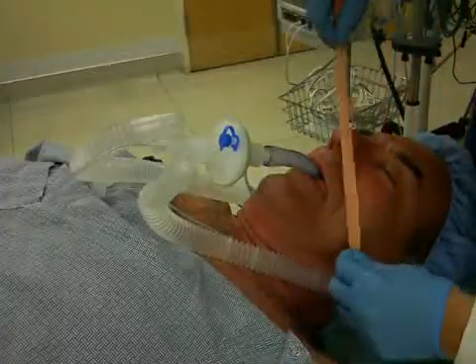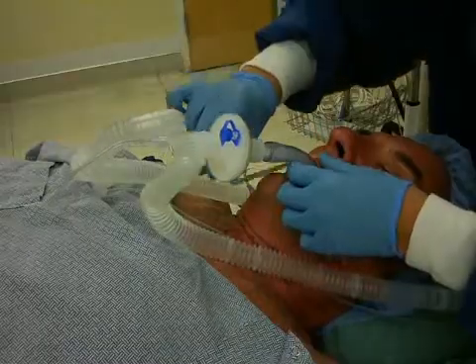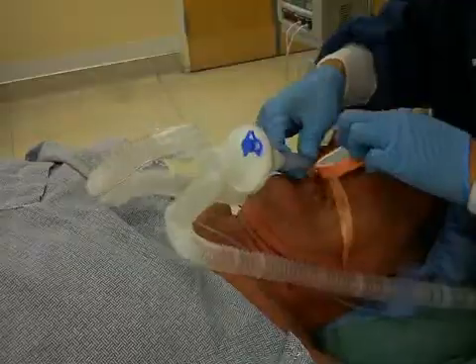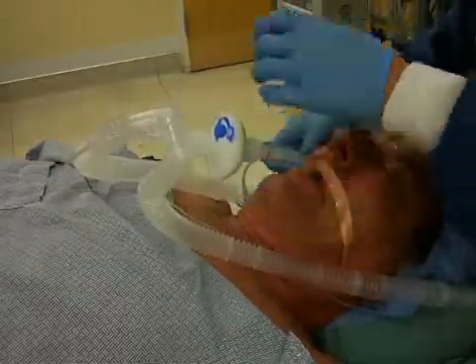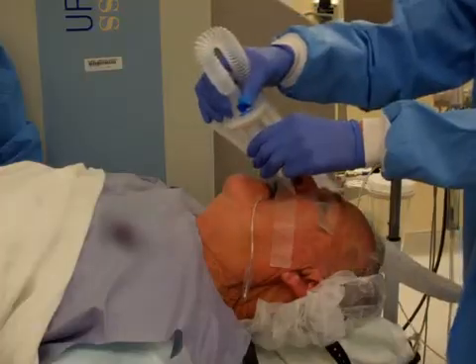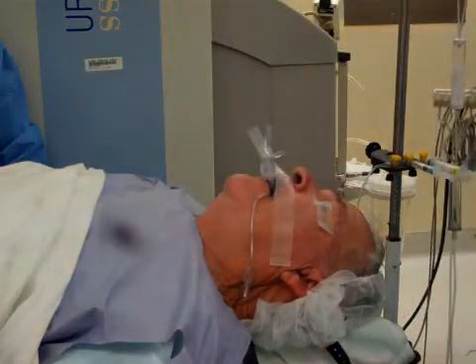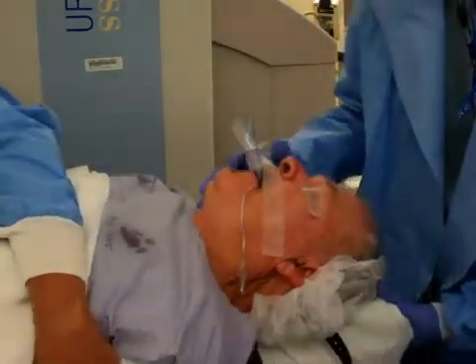Once adequate ventilation has been established, secure the laryngeal mask airway with tape to prevent movement of the device. Even when secured, the LMA may become dislodged with motions such as twisting or pulling. When moving patients, place one hand at the base of the laryngeal mask airway and disconnect the ventilation system from the device.